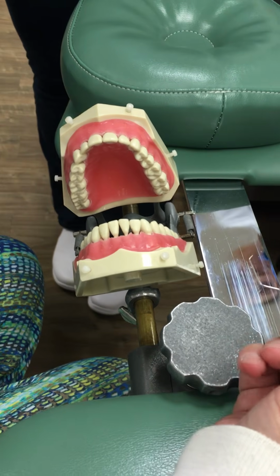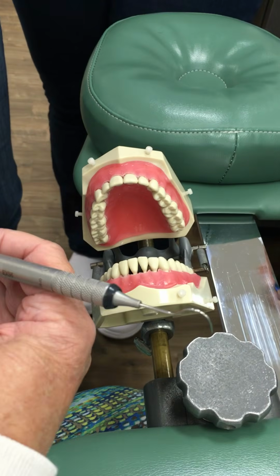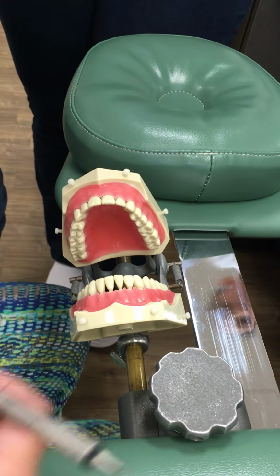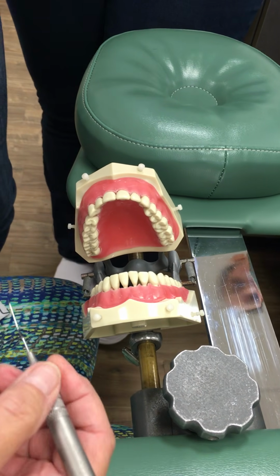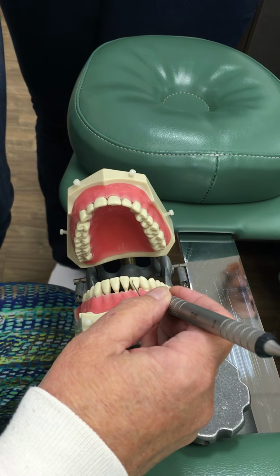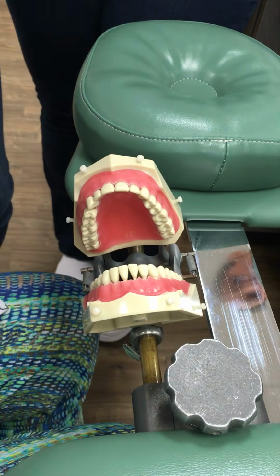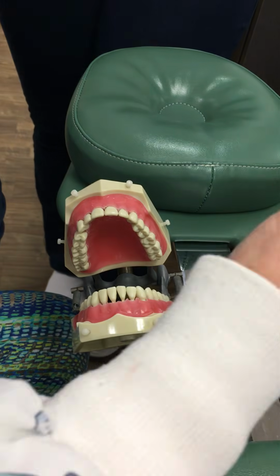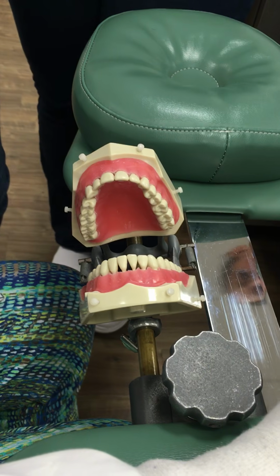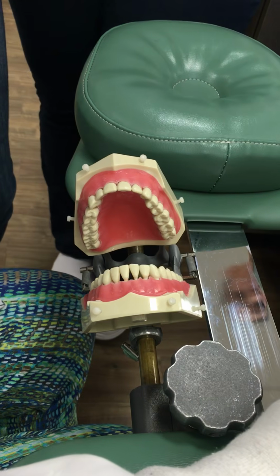All right, so we are going to do toward surfaces with us facing toward the patient. So we're going to be somewhere 8:30, maybe 9 o'clock, and we're going to do all the half of the tooth surface that are considered the toward surfaces on each tooth. Does everybody understand? All right, and we're now going to use our number 17 Explorer, which is on our number 5 Explorer. Is everybody with me?